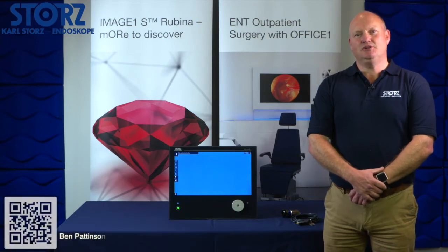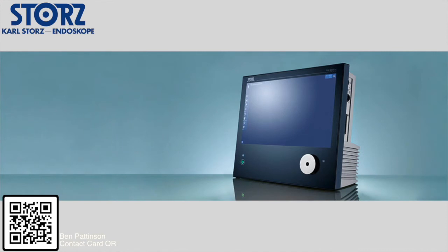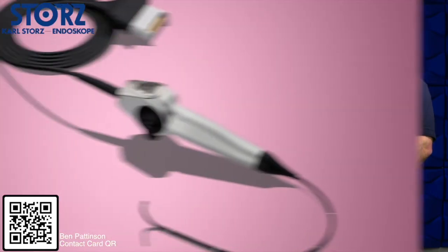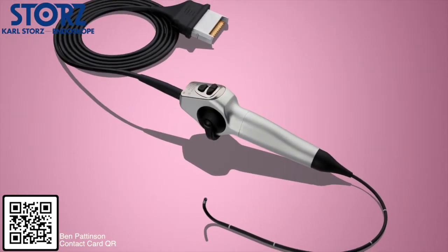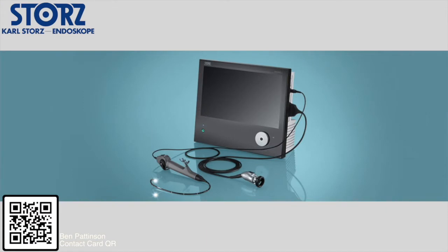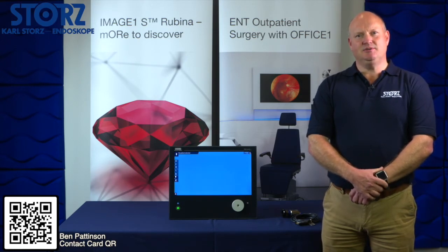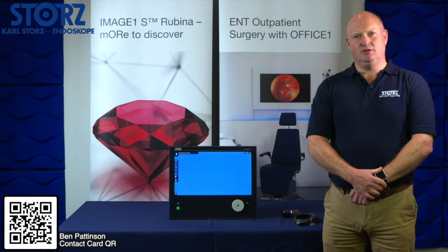Today I'd like to show you a new product which we've recently launched called the Telepac Plus. As you would expect, the new model has various improvements and new features. The first of those new improvements is a fully HD flexible video nasolaryngoscope. That flexible video scope will connect straight to Telepac Plus and will enable you to perform a routine nasendoscopy, as well as stroboscopy, and as well as enhanced imaging techniques using our S technologies and specifically Spectra modes.